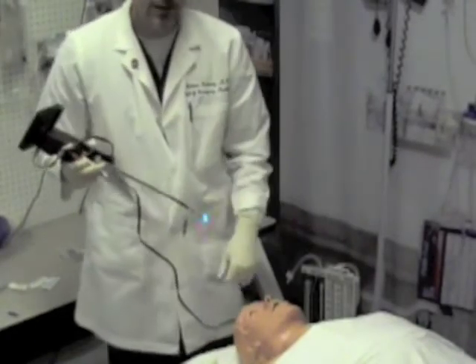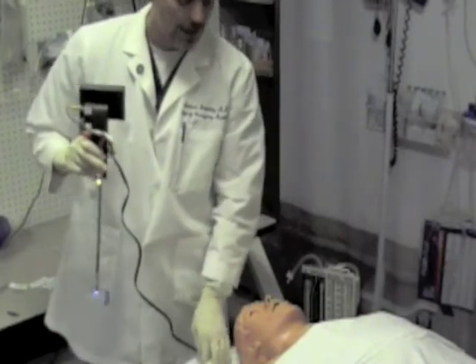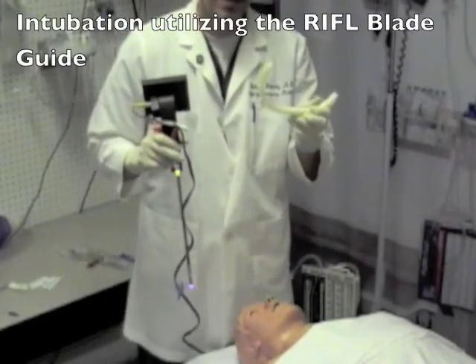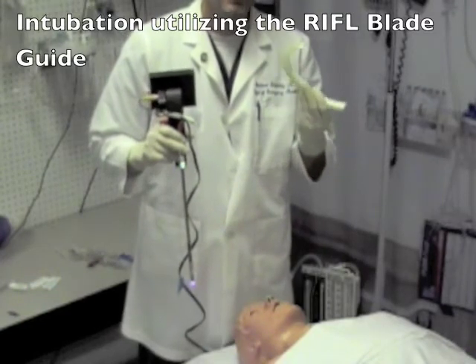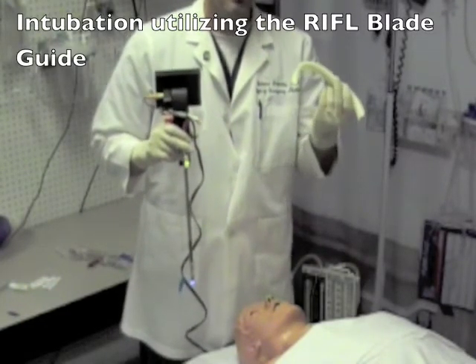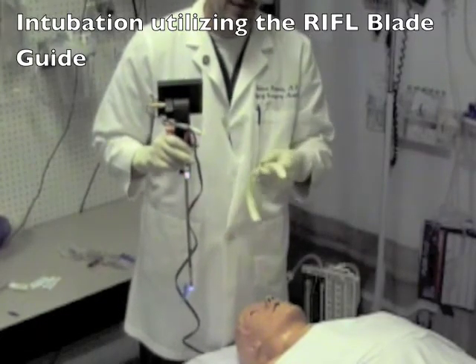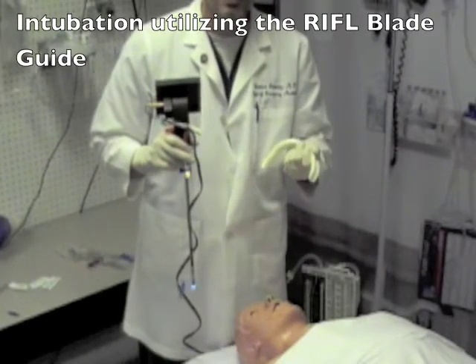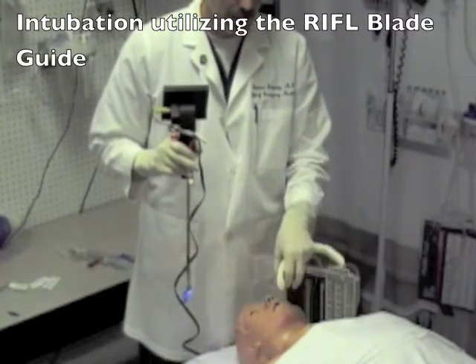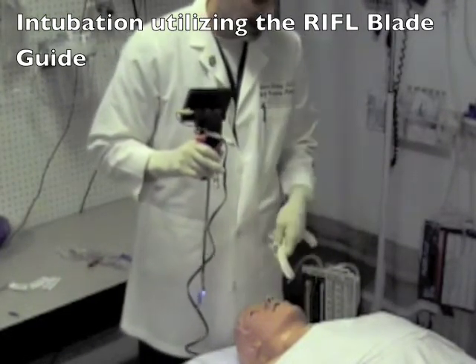Now to intubate using the Video Rifle, initially providers should use either the rifle blade guide or a standard laryngoscope to elevate the tongue to make visualizing the epiglottis easier. I will demonstrate that here on this mannequin. As you become more advanced using the device, you may want to use the device as a standalone using a chin-tongue lift, and I will demonstrate that later.